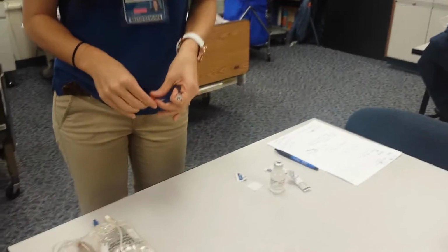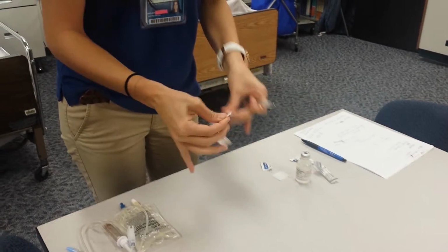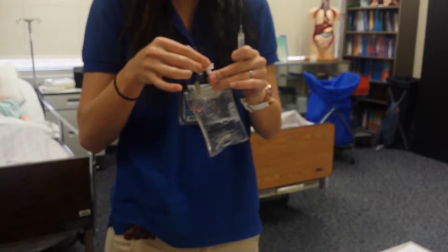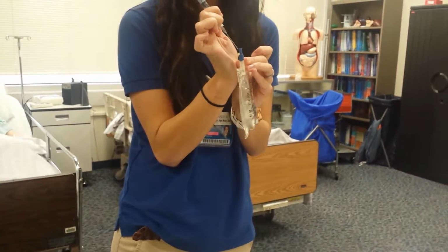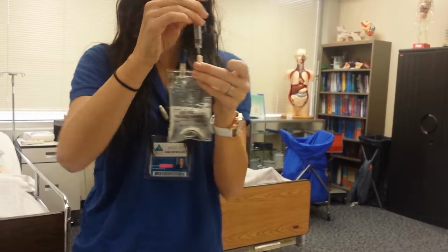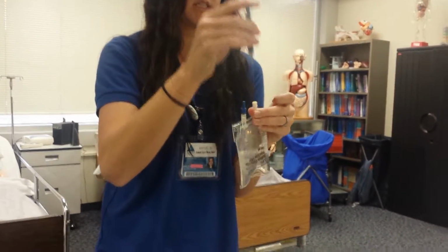And I'm going to come over here and clean the port on the 50 cc bag. So we're going to dilute the medication so it can run over a long period of time. So we're injecting 500 milligrams of Vanco into 50 cc's.